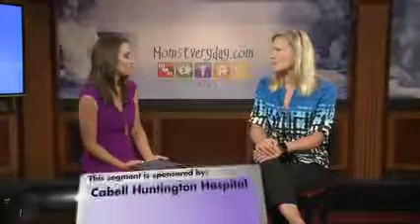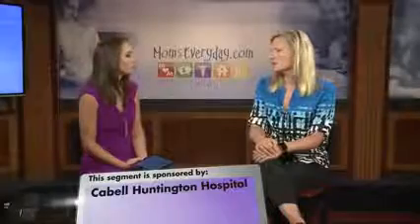What are some of the different surgeries that you use this on? Mostly hysterectomies. There are some others, sometimes just removing ovaries, but most often it's hysterectomies.